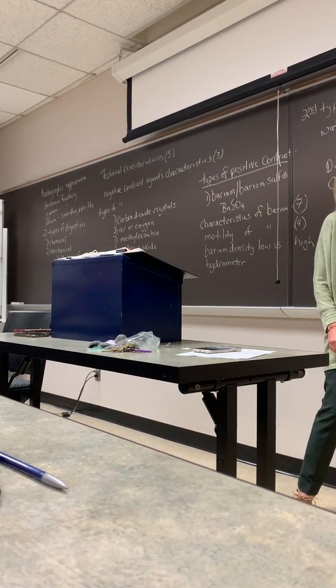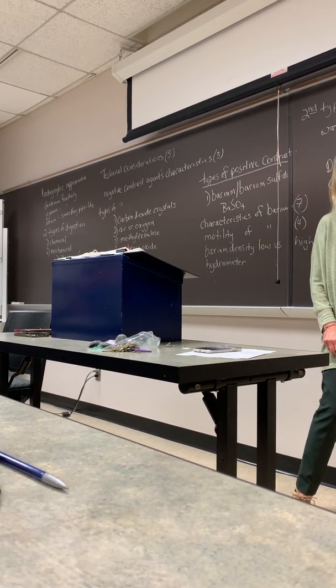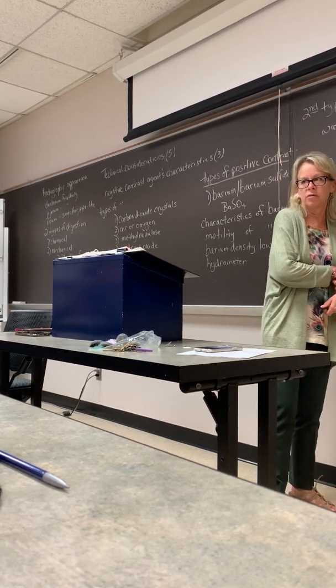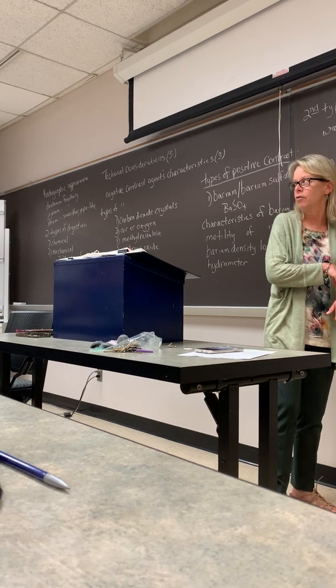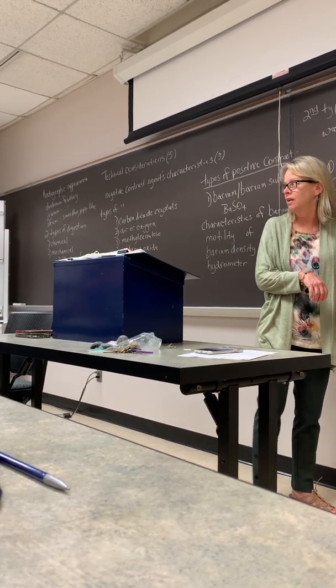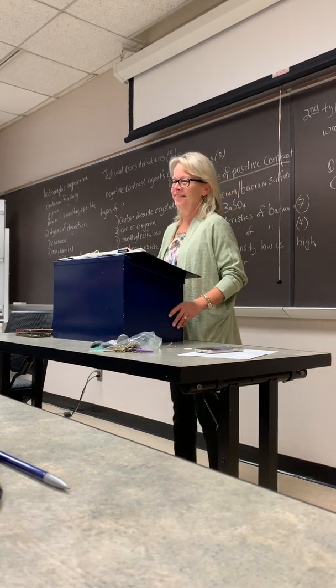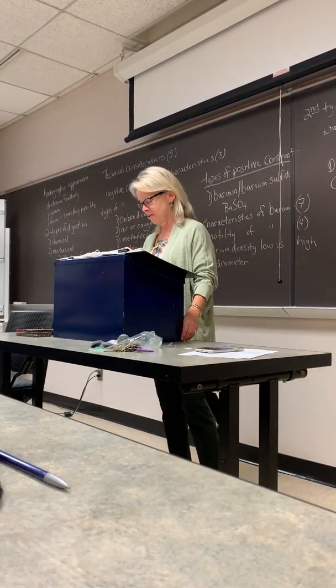If you work at Tampa General, Ivy tries to hide that he does it. He turns his back, he pours in a little bit of gastrografin to make it go faster. You've seen him do that? He'll say, you didn't see me do that. Every single time. It does move faster with gastrografin.